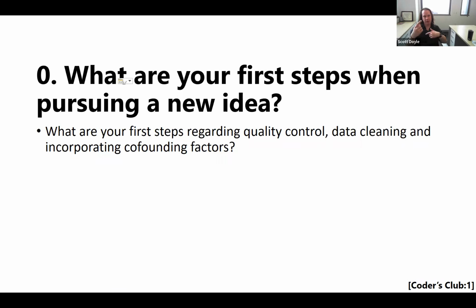And so that conversation helps to drive, not just quality control, but also what kind of quality do you need and what kind of noise are we going to have to deal with? Because to a pathologist, that's not noise. That's just what the data looks like. You just sort of mentally exclude that. But to the AI, we need to be able to identify that and deal with it.